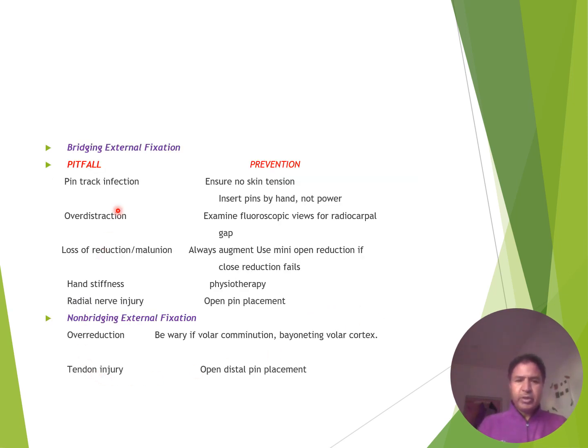Now we have bridging external fixation, pitfalls and prevention. Pin track infection: ensure no skin tension and insert pins by hand, not power.